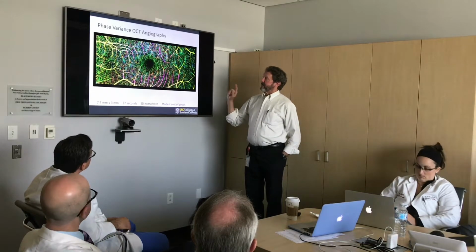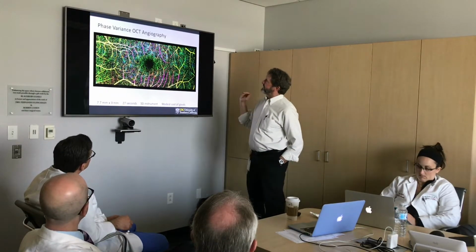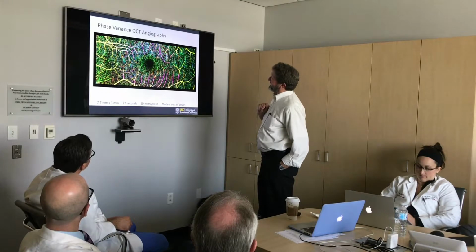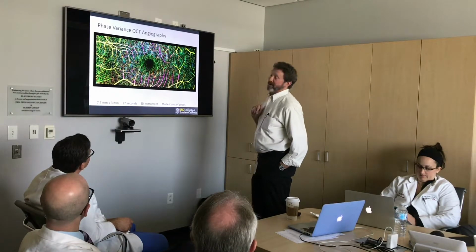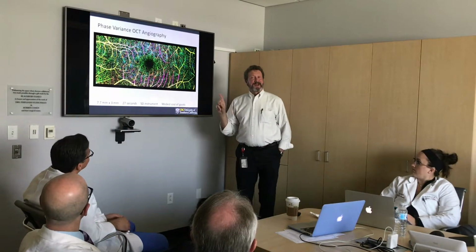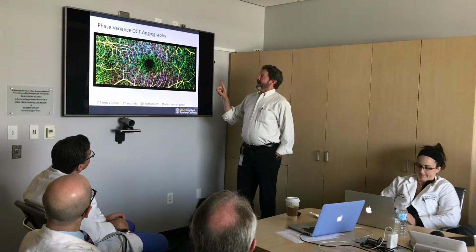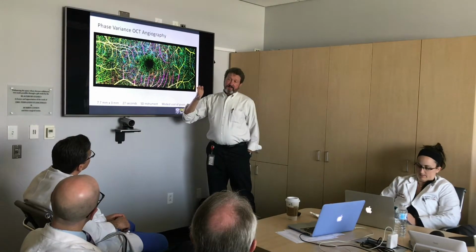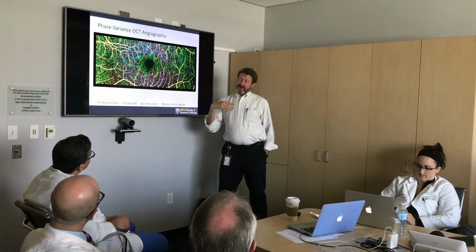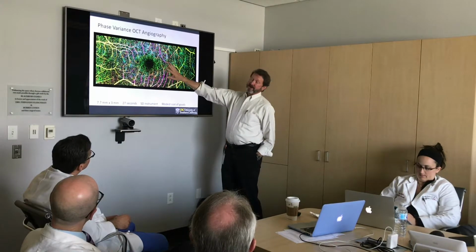That's a human retina. Since the vessels are different enough, that's not me. That's one of my ex-postdocs, I think. But anyway, this is just looking at the variance in the phase of the signal that comes back. Intensity-wise, you wouldn't see it.